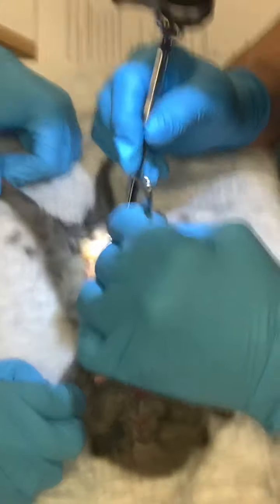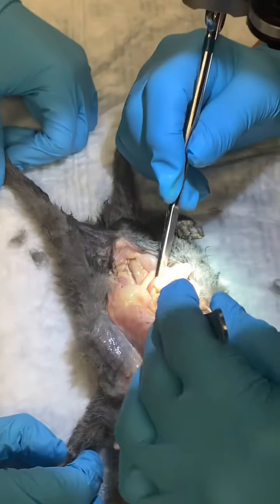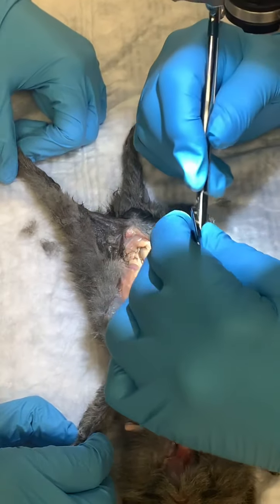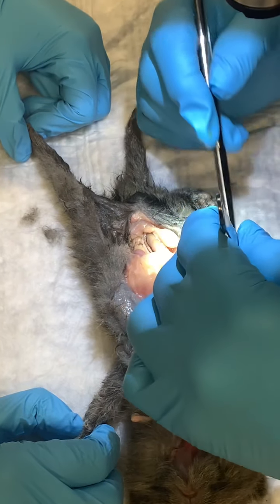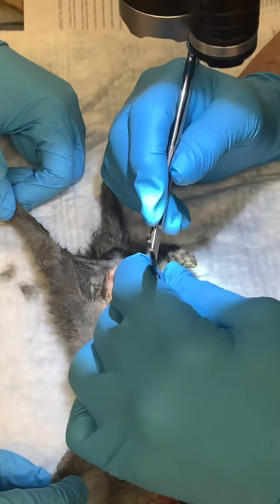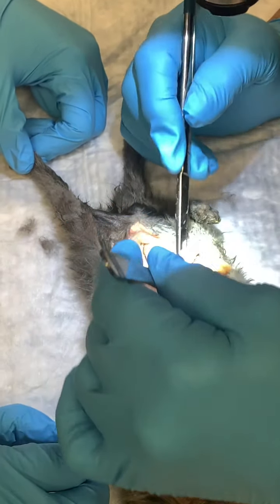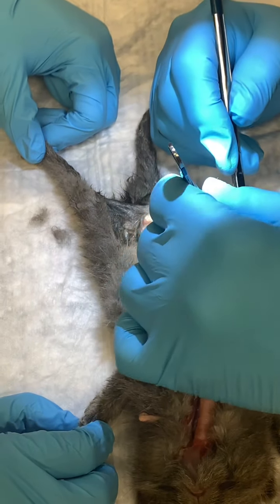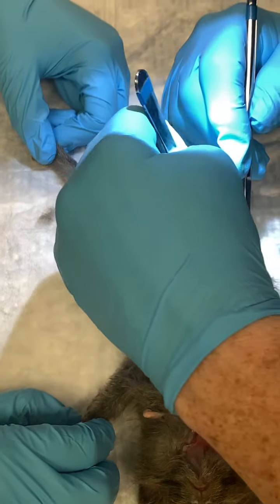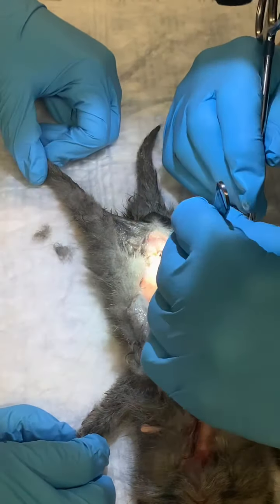Let's go together. So there's all the small intestine, and then there's the mesentery, and it's got a lot of chyle in it, or lymphatic tissue. Maybe that's not normal. I think it means there's a backup of it. Is this still more the spiral?